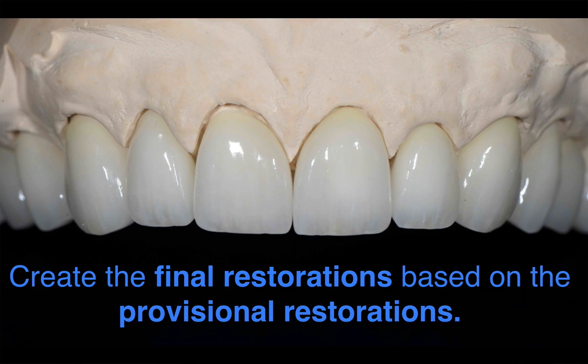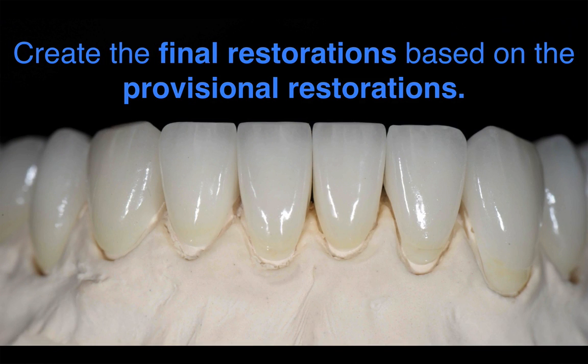And then what I said earlier is we create the final restorations based on the provisional restorations. The provisional restorations were created based on the diagnostic wax up. So we are, again, using the wax up as the blueprint. So here are the restorations. These are Lava zirconia crowns, layered Lava zirconia crowns. You know, this case was completed about 4 years ago.